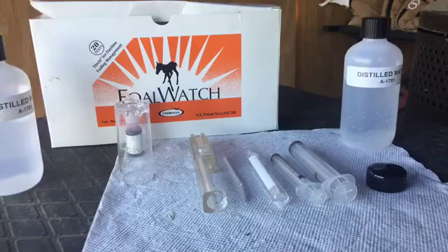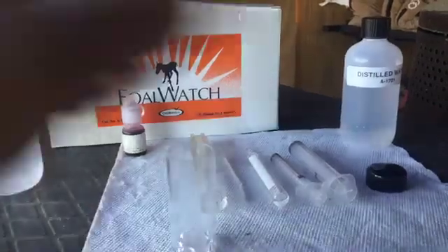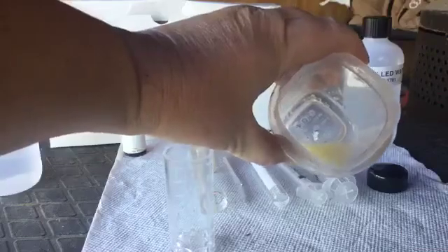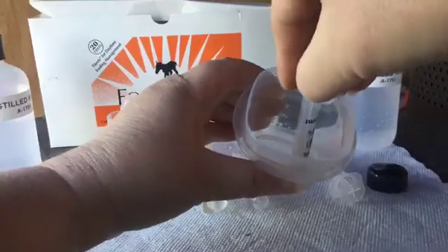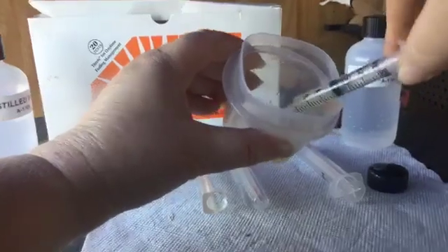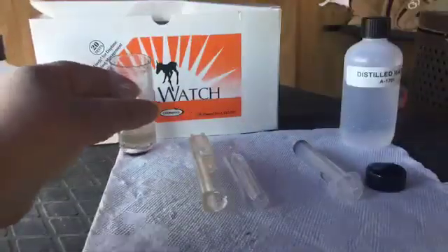There you see all of our utensils that we use. What we will start to do is take this plastic container here, open up the milk that was drawn a few minutes ago, show you the consistency of it. We take this syringe that comes with the kit, pull one and a half milliliters, put it in this container. We are done with the milk, I am going to set it aside.